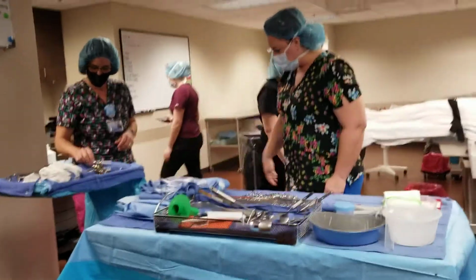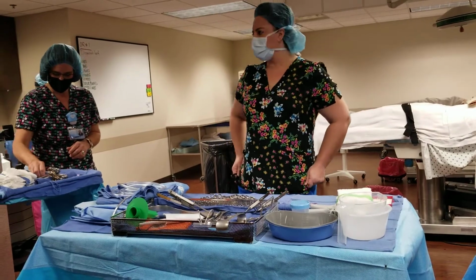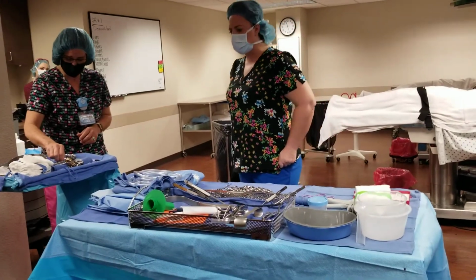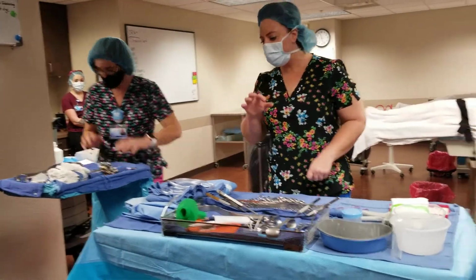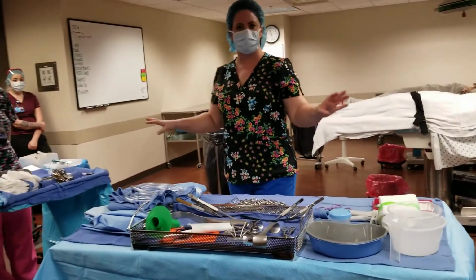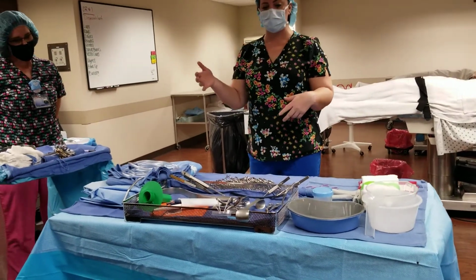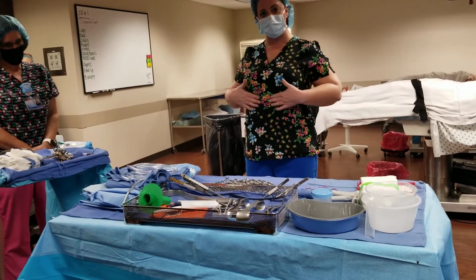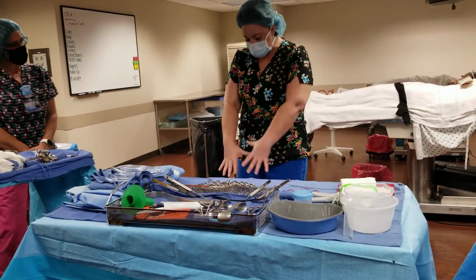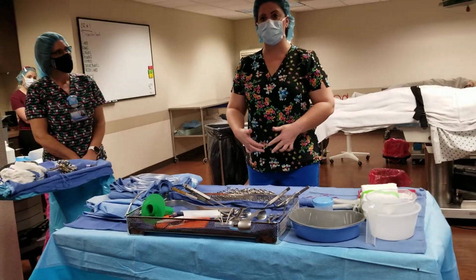Wear your knee-high boots because it's the wettest, bloodiest case you'll probably ever do. So, the wonder of childbirth. Once you get draped, which is just the typical draping. Out in the field, you might see a special C-section drape with a round little thing for the tummy and a big pouch around it to catch some of the goodness.